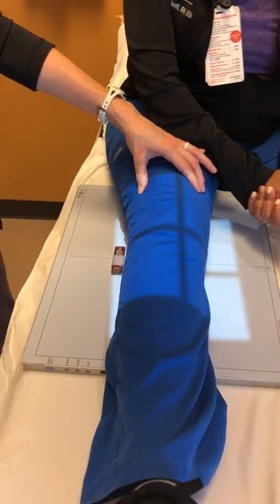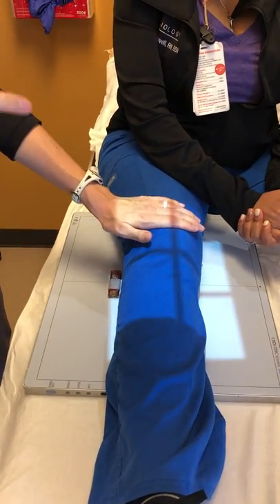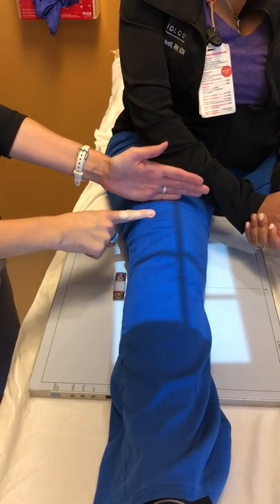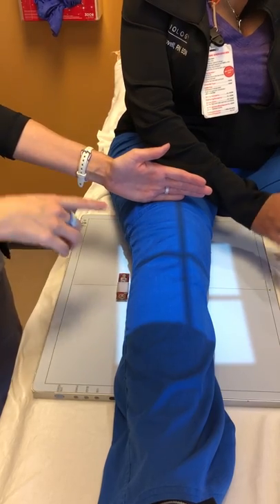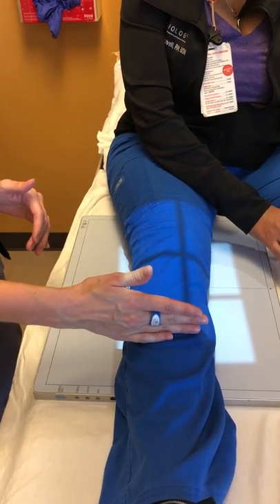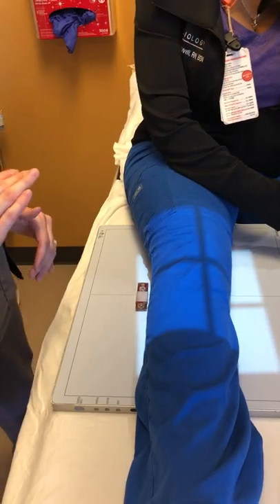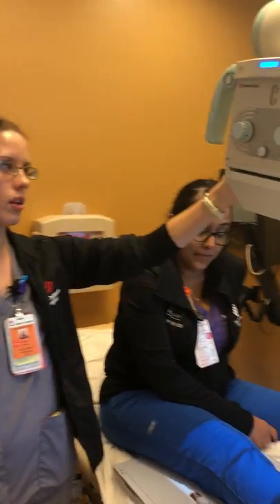For top-to-bottom collimation, you want approximately four inches above the joint to capture the distal femoral bone, and also about four inches below the joint to capture the proximal tibia and fibula area.